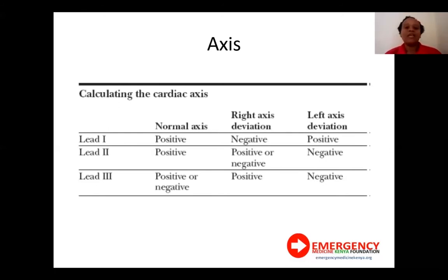And a very easy way to look at this, and we said from the beginning, is that what we are dealing with is the basic knowledge to be able to know whether our ECGs are normal or whether they are abnormal.